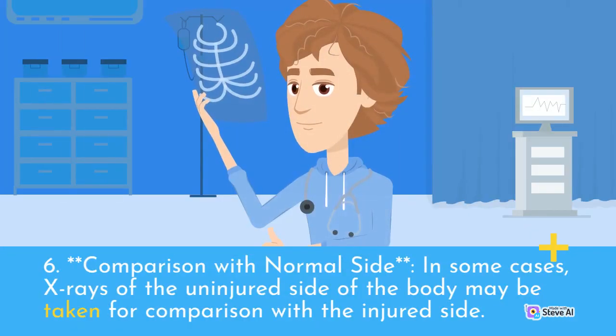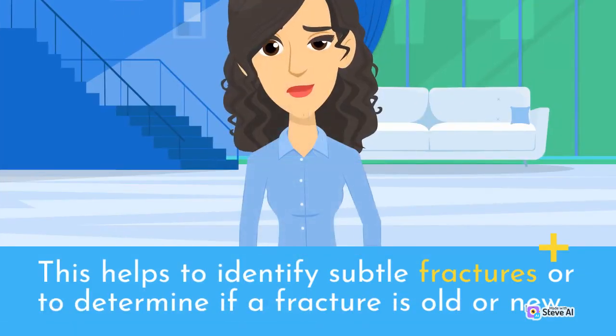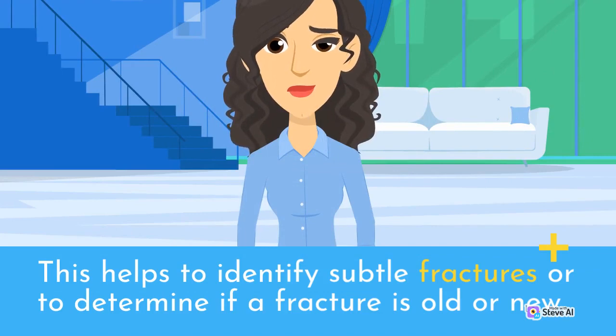6. Comparison with normal side. In some cases, X-rays of the uninjured side of the body may be taken for comparison with the injured side. This helps to identify subtle fractures or to determine if a fracture is old or new.